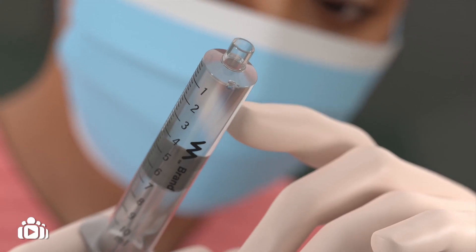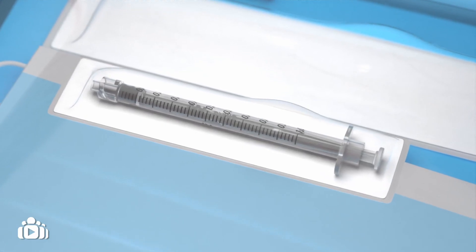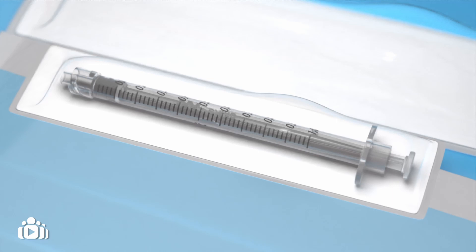Prepare the pre-filled saline syringe from your medical set. If prescribed, you should also prepare the taurolidine lock in a 1 ml syringe.